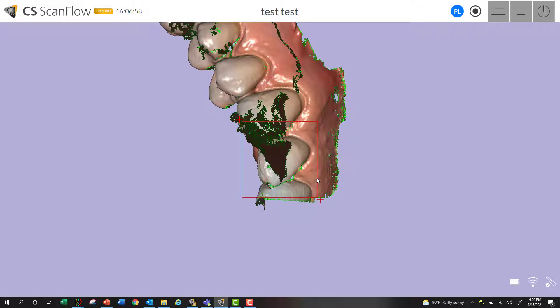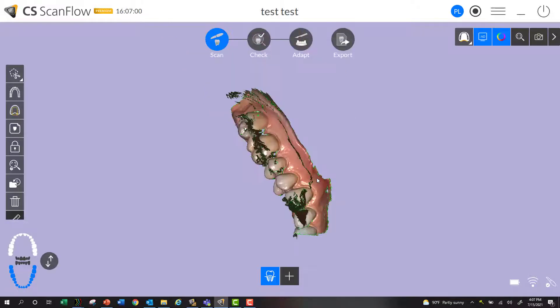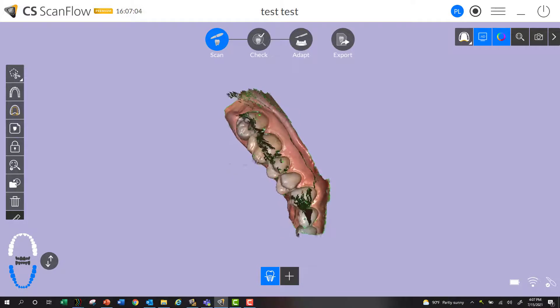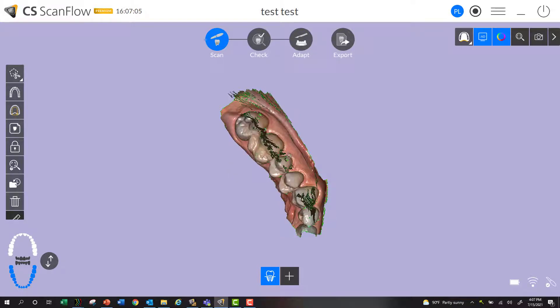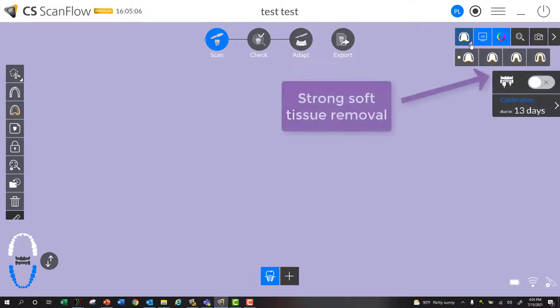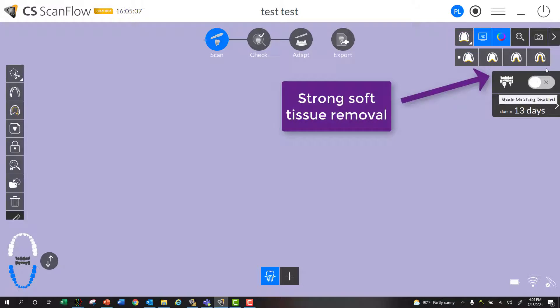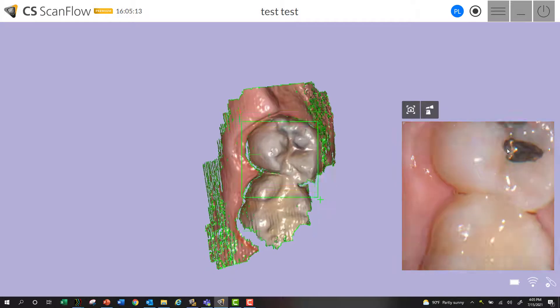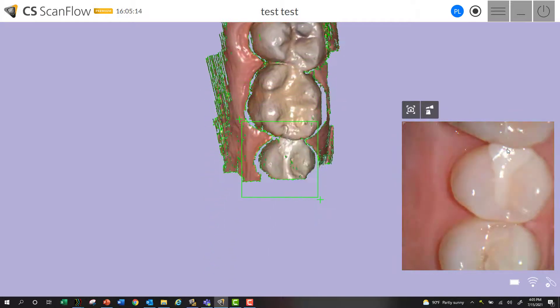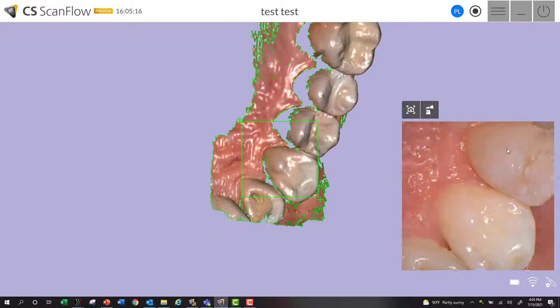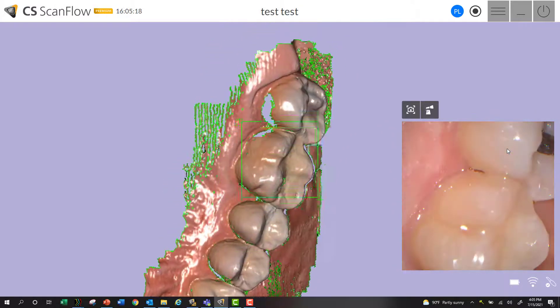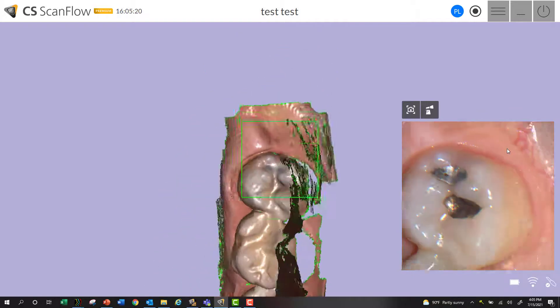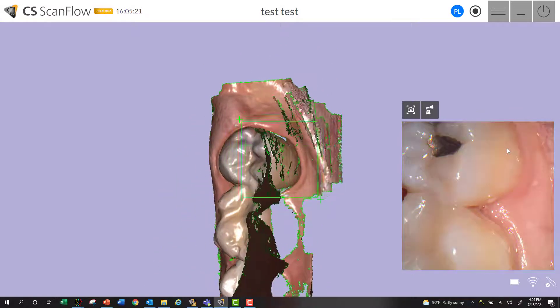Now we know it does get rid of a lot of that or most of it in the check step, but sometimes it's nice to have that removed while you're scanning. So here's the same scan with the soft tissue removal set to strong. I'll scan with the 3800, roll to my lingual, purposely catch a bunch of my cheek, and then when I roll around to the buccal, do the same exact scan.